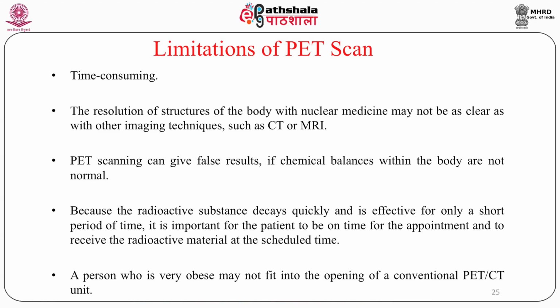A person who is very obese may not fit in the opening of a conventional PET CT unit, and this is very well true in case of other examinations also. If a patient is obese, he may not go into the gantry because of his weight and other reasons.